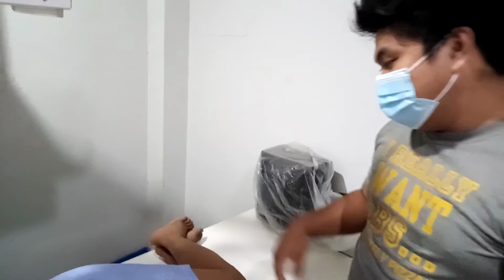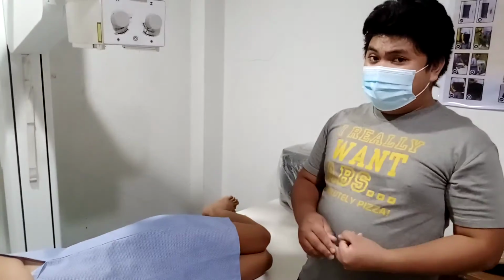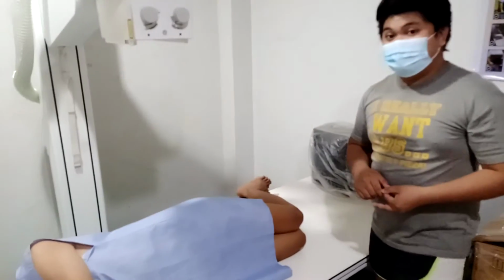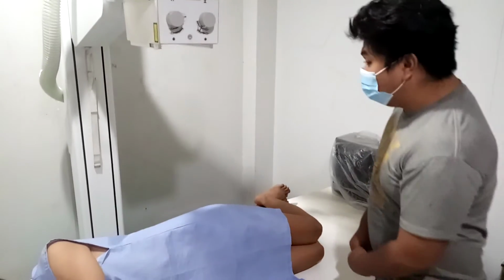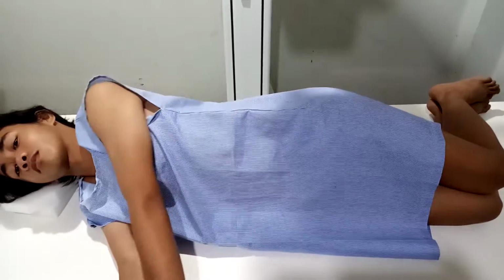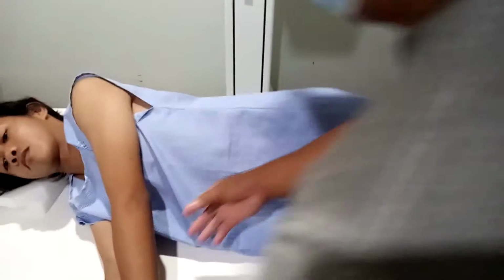So if you're going to straighten his hips or his knees, we intend to increase the lordotic curvature of the patient. Then if we're going to flex his knees, we intend to decrease the lordotic curvature of the patient. Then in part positioning, center the IR to the level of the iliac crest, as usual. Center the mid-coronal plane of the body to the grid. Extend the arms forward.